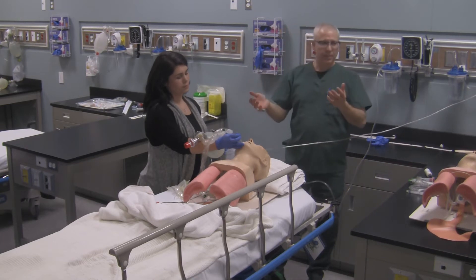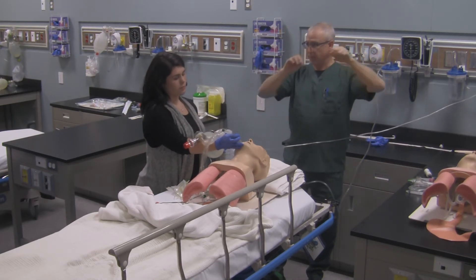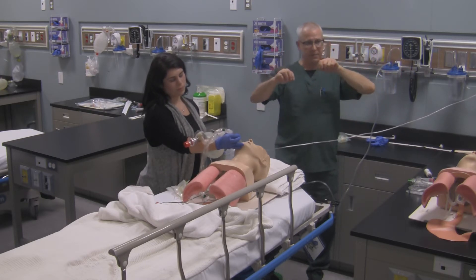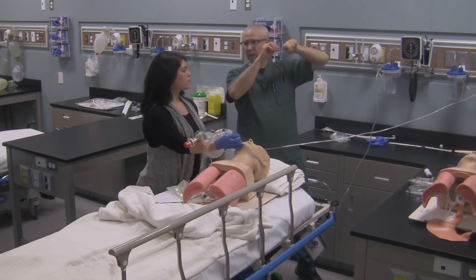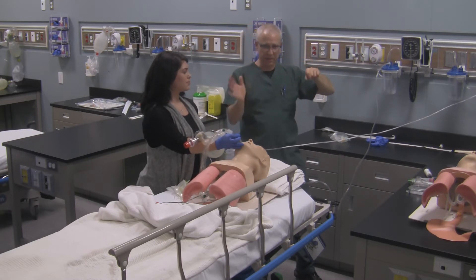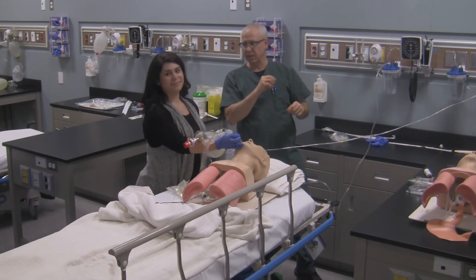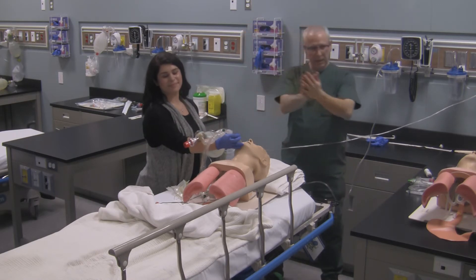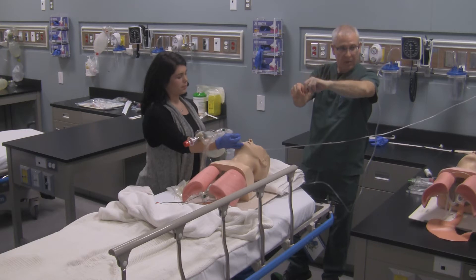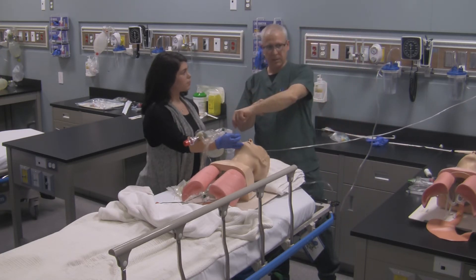When you start taping, split the tape in two parts length-wise — that's why you made the cut through the top so you could tear the tape. You'll have two halves: top half and bottom half. The order for the tapes is bottom, top — starting from the side the tube's on. The top tape goes around the endotracheal tube. Then you go to the other side, split the tapes into two halves again; start with the top one on the tube, then bring the bottom one up to secure everything in place.